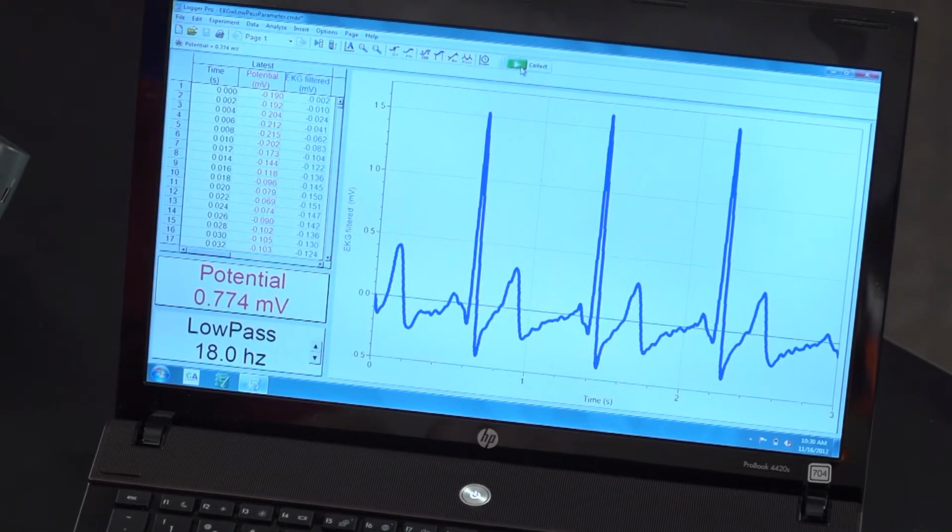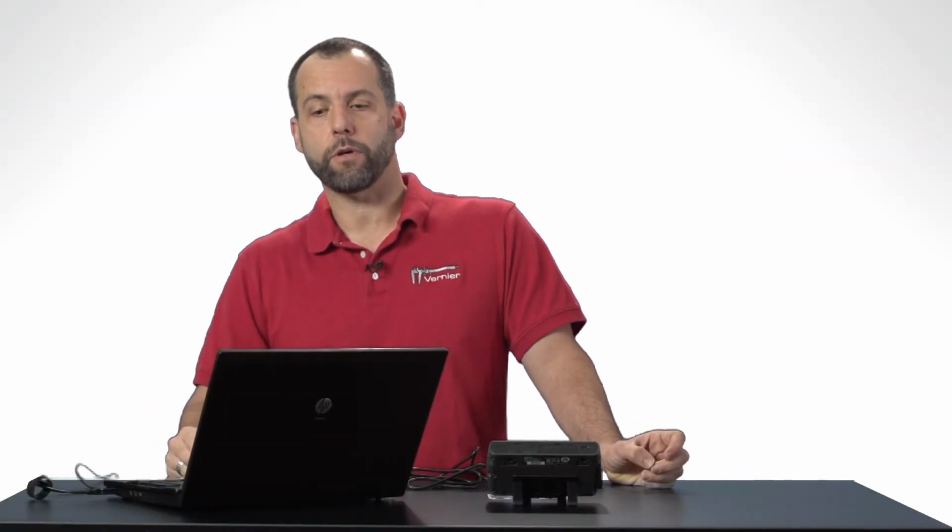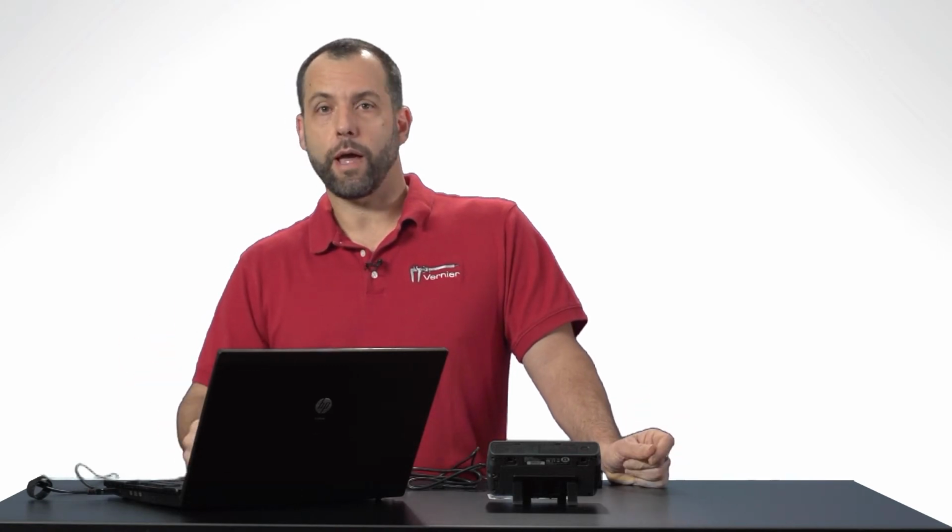Now hopefully what you notice is that these EKG traces are much sharper. So the QRS complex is much taller and much sharper than it was in the other file that I showed you. You also might notice that the P wave is much taller and the T wave is much taller. What's really nice about digital filtering is once you've recorded the data, you can modify the filter and the data is still there. You don't have to record over again.